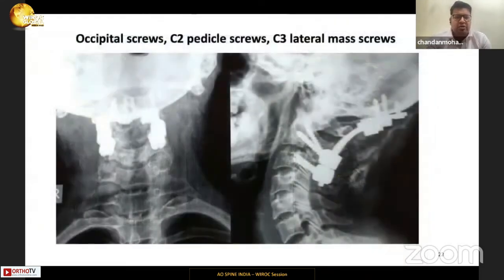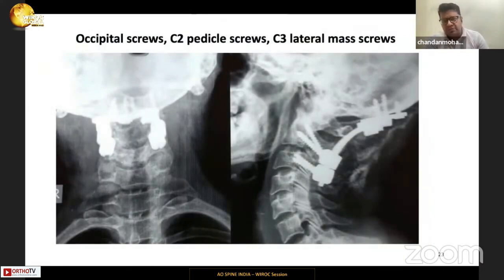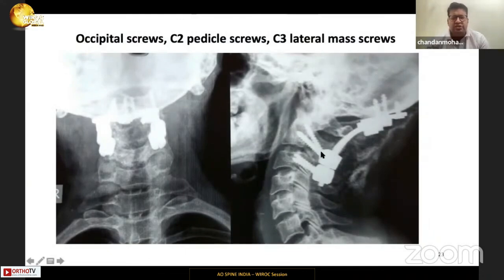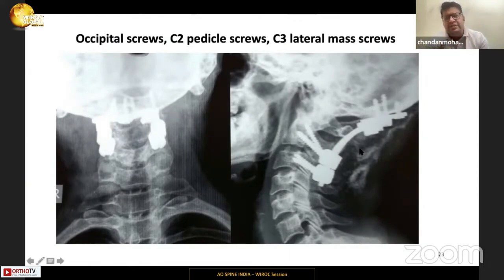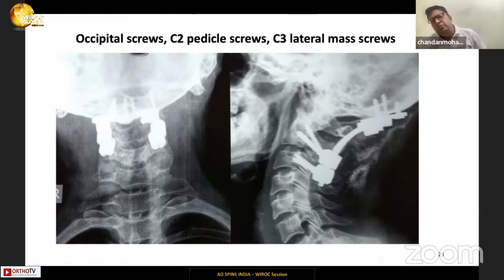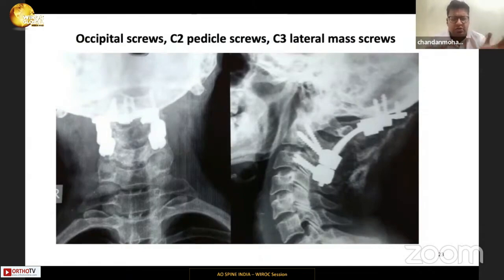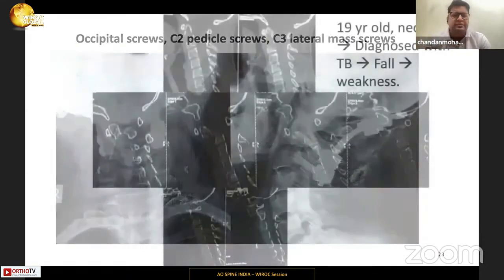This patient underwent occipital C2-C3 instrumentation. The occipital screws are bicortical and a C2 pedicle screw is placed inside the C2 vertebral body. We prefer to extend the construct in these cases because the patient will receive radiotherapy following tumor excision, leaving no chance for bony fusion. To achieve a biomechanically strong construct, we prefer to go long.